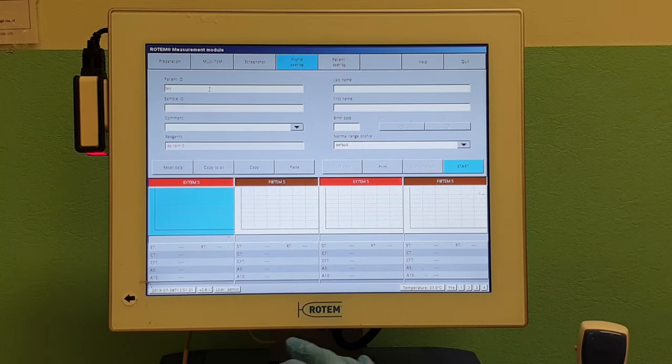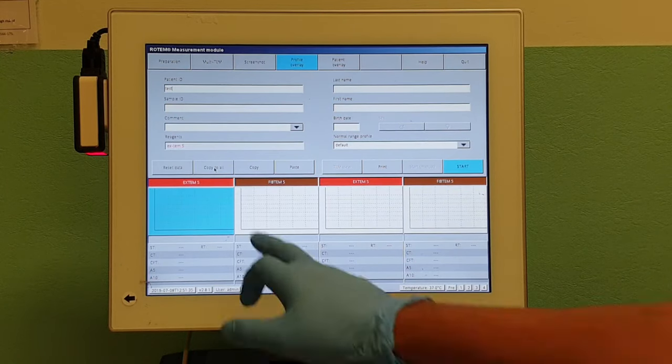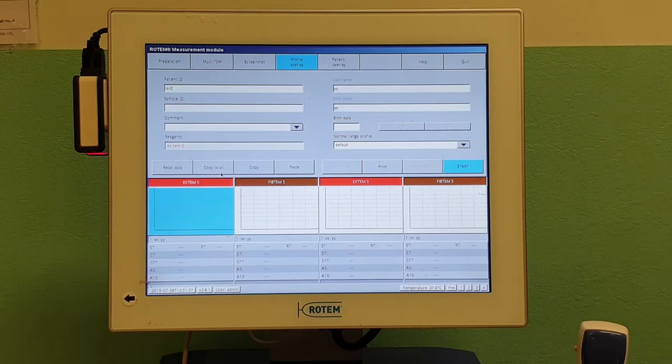Once on the patient overlay, you can put the patient identification in, which can be a number or name, and then press 'Copy to All'. It will copy to all channels, saving you time.